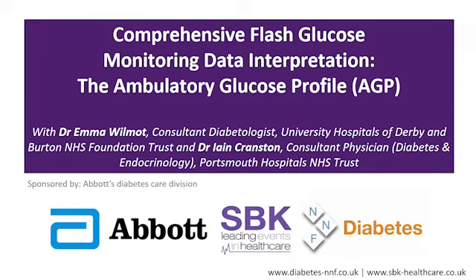And for most of us, trying to picture that from numbers is actually quite difficult, whereas when we see it visually, it's much more straightforward. So when you see lines going down, you can say, well, actually, at that point of time where a glucose profile is falling, there is effectively more insulin action than I would routinely need if I wanted to keep it flat, and vice versa if the glucose is rising.